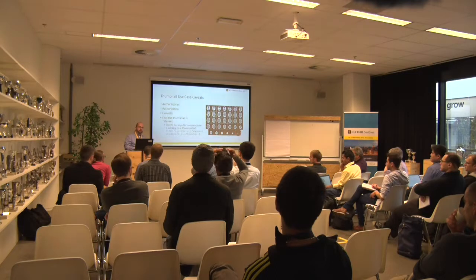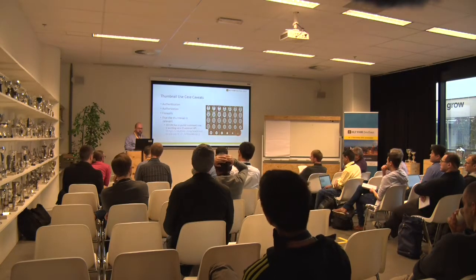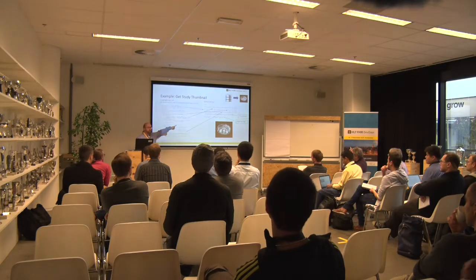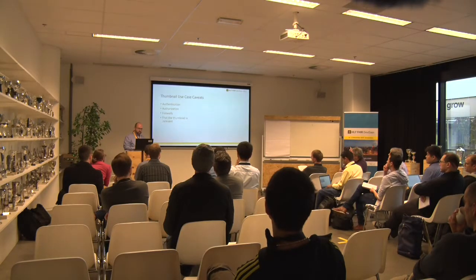That would be a DICOMweb feature. Yeah. So when you make the WADO call, one of the other parameters you can put on is the quality. It's just another parameter that you can put on for that.